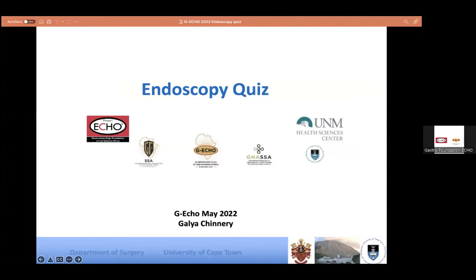Okay, perfect. We're going to have a fairly relaxed session today, so no hard theory or anything like that. What today is about is essentially I'm going to be showing you a couple of videos that are not perfect. They are exactly as we have experienced them. They are taken from our endoscopy suite on a scope list when we're doing a list, which we hope to show you something specific.